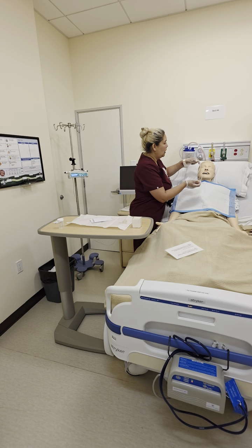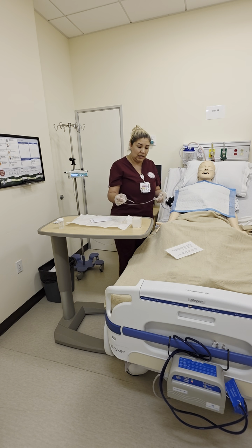All right. And I'm going in, suctioning. I will not suction for more than 15 seconds. Okay, and on the way out, I'm going to pulsate on the wide tubing here. Perfect. I'm going to oxygenate my patient, and go ahead and take a couple deep breaths, please. Okay, clear that out, clear out the line.